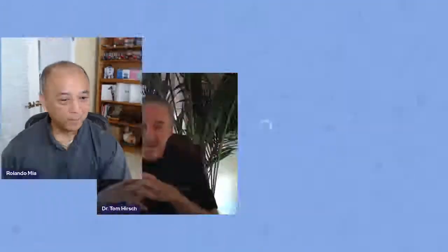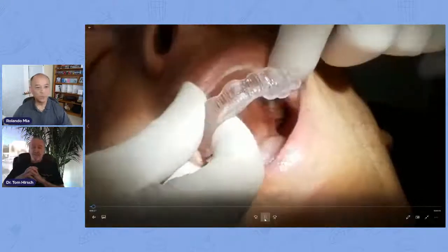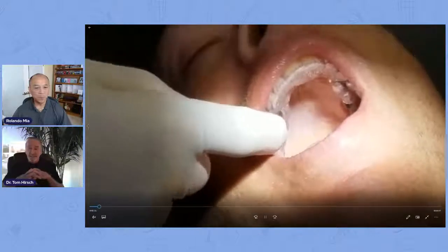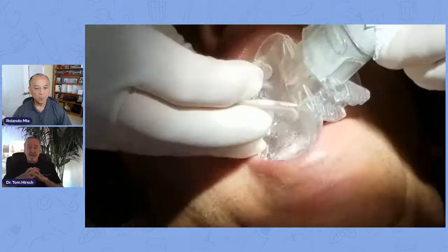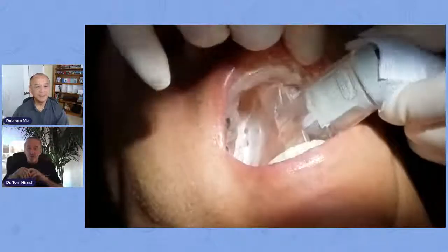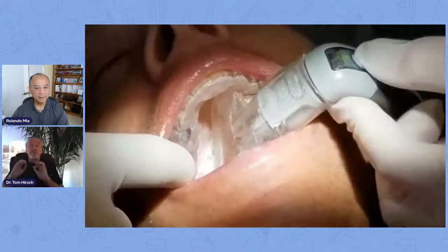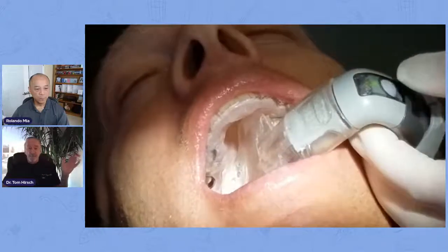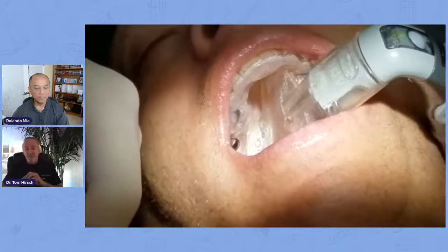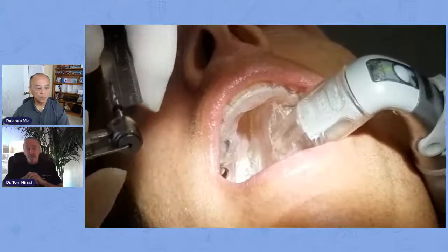So we're talking about guided surgery and Isolite. That's my surgical guide — I have CCAT make those for me. It's been said that you can't use an Isolite with guided surgery. Well, sometimes you can and sometimes you can't. If you just don't have any room at all, then you cannot use Isolite with guided surgery. But most of the time — and I do a lot of implants — most of the time when I do my implants, I do them guided, almost 95% of the time. And on that 95% of the time, I usually use an Isolite with it too.